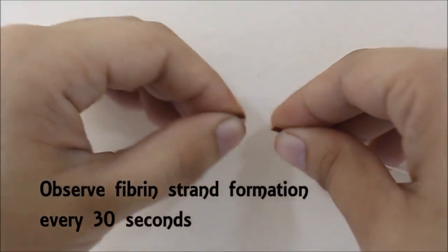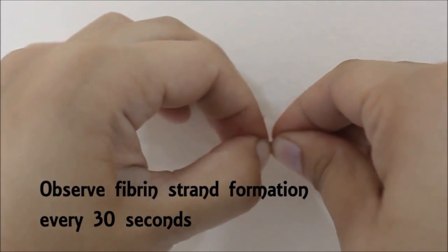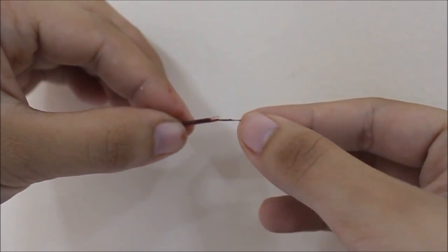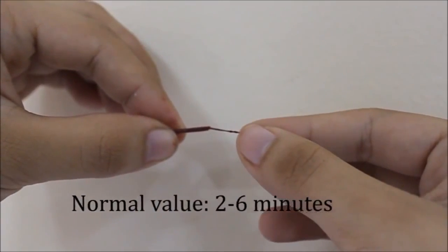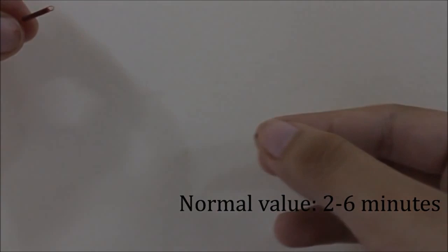Take note of the formation of a fibrin strand that fills in the gap between the capillary tube and the broken piece. The time that elapsed is taken as the clotting time. The normal value for the capillary method is 2 to 6 minutes.